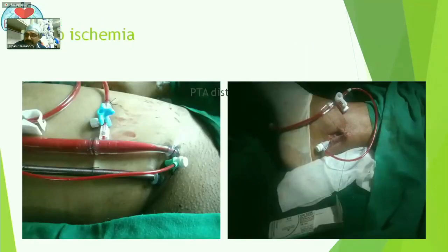And limb ischemia is a problem, because in that hurry, everybody wants to put the patient on ECMO first rather than taking care of the limb. So if within one or two punctures you are not getting the distal perfusion cannula in, don't waste time on it, because it is going to hamper your patient's outcome. Put one venous, one artery in the groin, and leave the distal perfusion. Don't attempt it at that point of time, because you have no pulse or a very thready pulse.